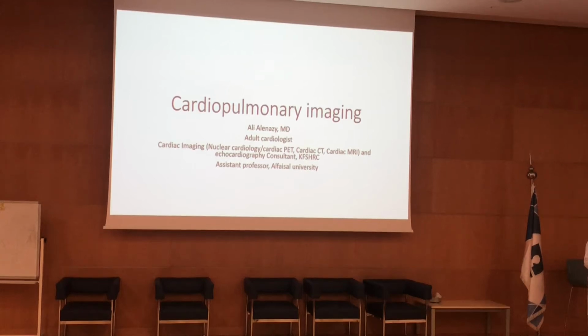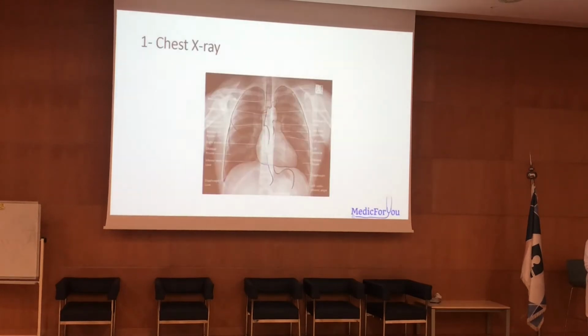So echo is ultrasound; radiology calls it ultrasound, but the other name we call it is echocardiography. And CT, somebody mentioned CT, as well as MRI and nuclear cardiology. So we'll go through them one by one.